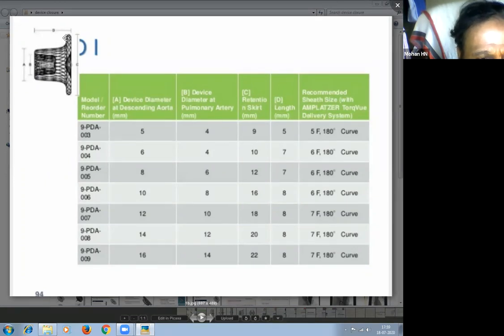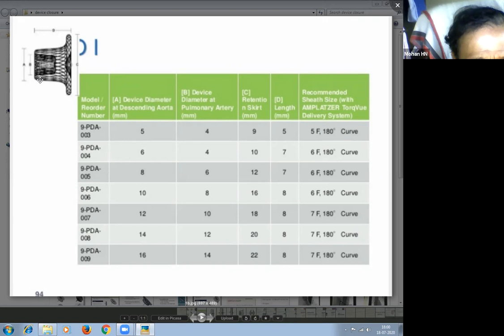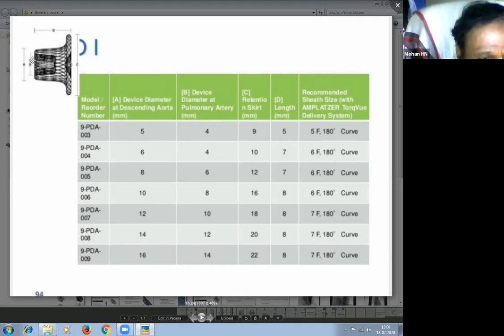Plus 2 plus 2, 4 millimeter extra, so from here to here is 12 millimeter. Here it is 8 millimeter and 6 millimeter. From here to here it is 7 millimeter. Which one is 6? The 6 is this one, my arrow is moving from here to here. It's a 6.